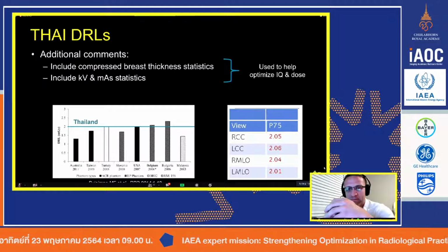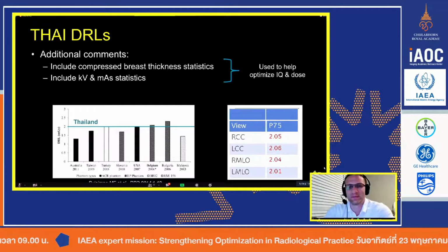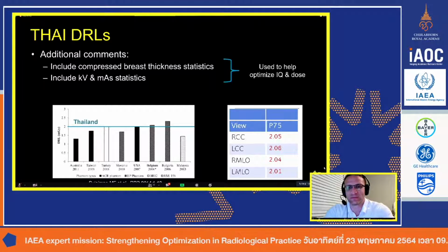And sometimes we don't really know why the image quality from this vendor is better than other vendors. So our idea just gets fixed to, this vendor is better than other vendors. This helps us understand that it's because of the filter they have that made the better image quality. That's why you like it.